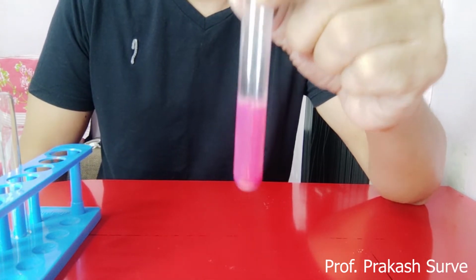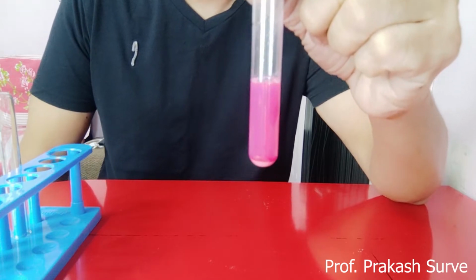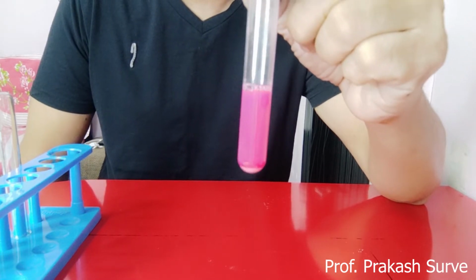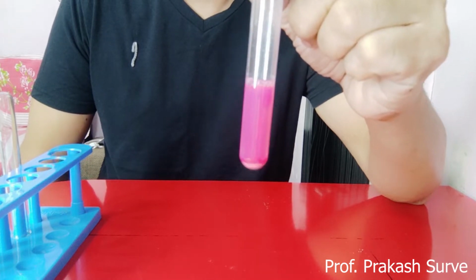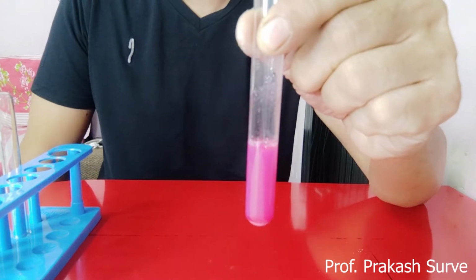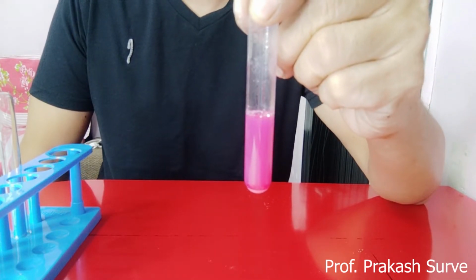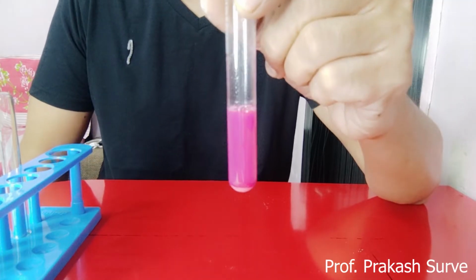Suppose the amount of urea in the blood is more than 20 to 40 milligram per 100 ml of the plasma, it is called uremia. Uremia indicates a disease of the urinary tract. Okay, so this is what we have performed, the test for urea. This is a positive result that we get in this urine sample.